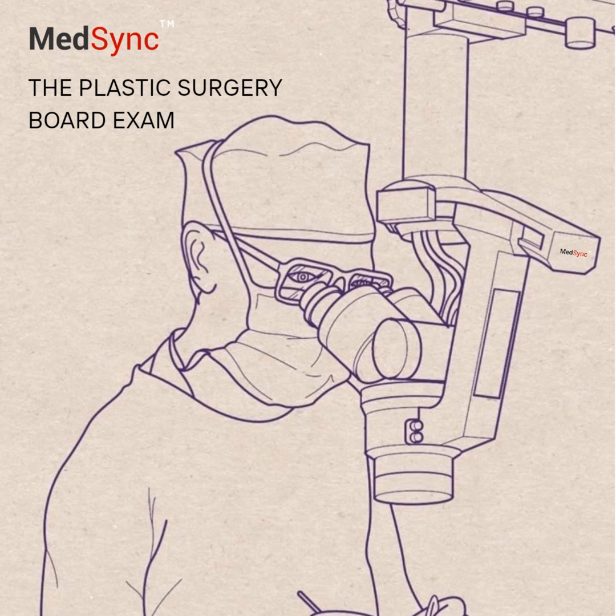Okay. Sternal wounds and mediastinitis post-cardiac surgery. Big problem. Huge application. Often the primary initial treatment after adequate debridement. For more superficial sternal wound infections, it can manage drainage, splint the sternum, and sometimes lead to healing without more surgery. And for deep infections, mediastinitis? It's often used as a bridge. Stabilizes the chest wall, manages the infection after the patient is through the initial sepsis, maybe respiratory complications, allows things to cool down before definitive closure, often with flaps.